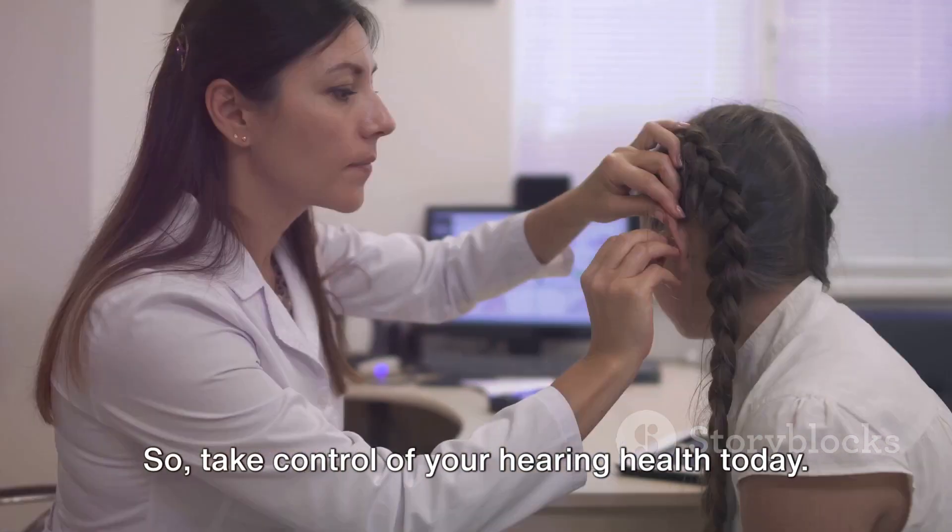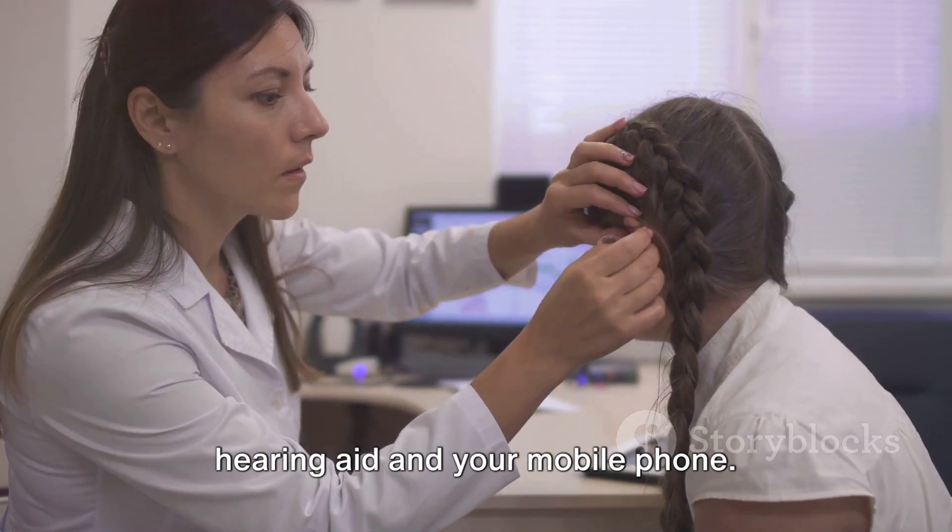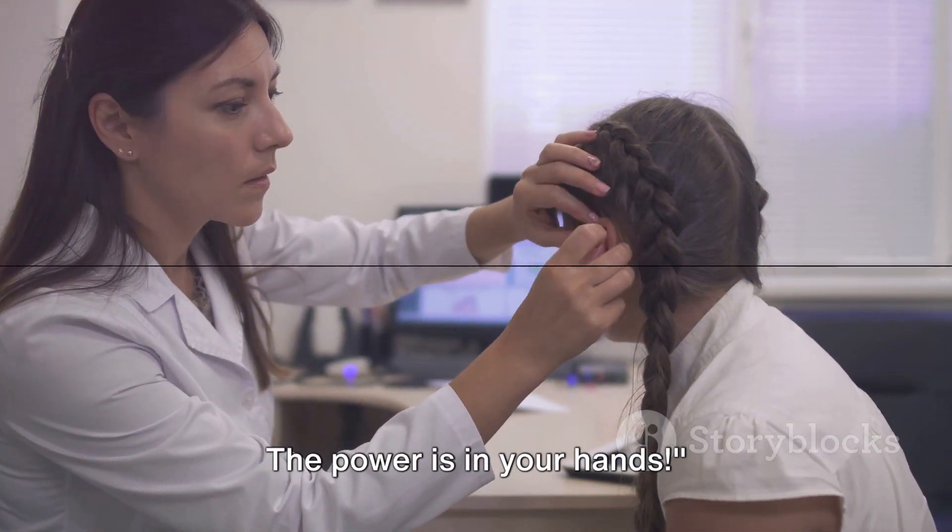So take control of your hearing health today. It's time to unlock a world of better hearing with your hearing aid and your mobile phone. The power is in your hands.